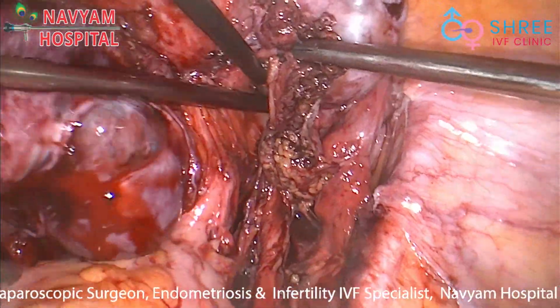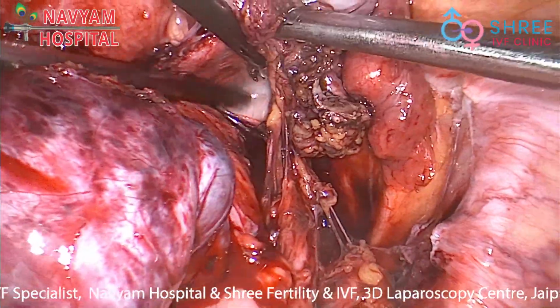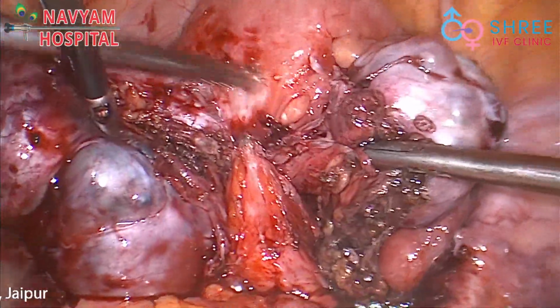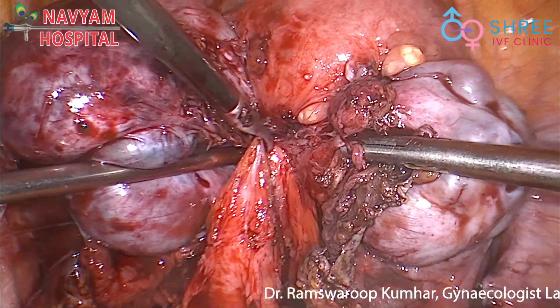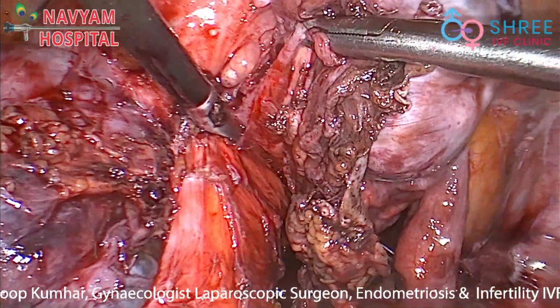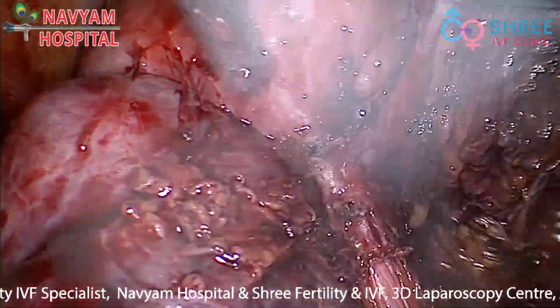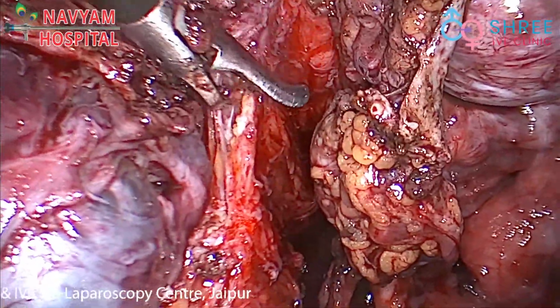You can see we are trying to dissect it very gently by blunt action, and we went deep down on both sides of the rectum. Then, securing the rectum, we cut the middle portion of the adhesion, but very gently. Gentle cuts were made. Blunt as well as sharp dissection was carried out here to dissect the rectum away from the cervix and the vaginal wall.